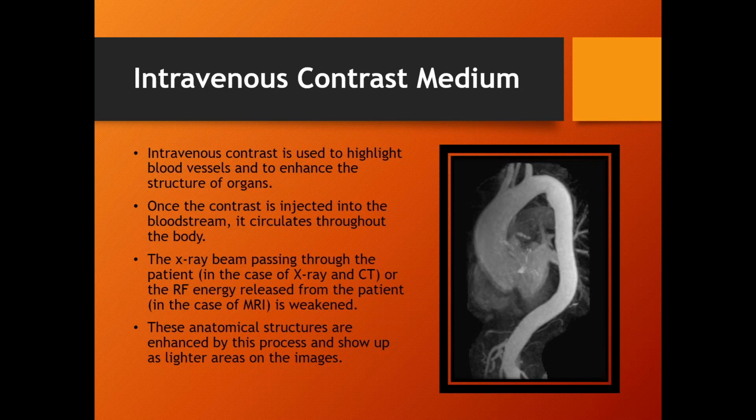Now, angio and CT, the 2 that use X-rays to produce the images, the magic ingredient in this syringe right here is iodine, all right? Something about the atomic structure of iodine. It has a number of electrons in its outer shell spinning around the nucleus that it blocks X-rays, okay? Iodine, short and simple, blocks X-rays. So the main ingredient in CT and angio injector syringes is iodine. So they're injecting that in the patient's blood vessels to block the radiation.